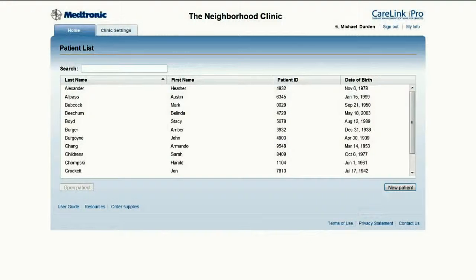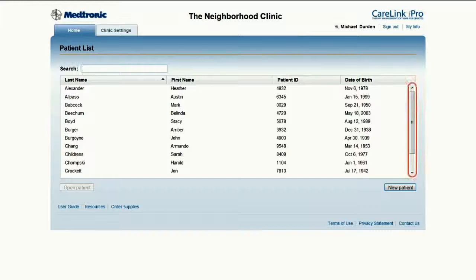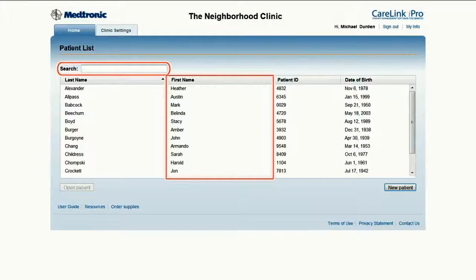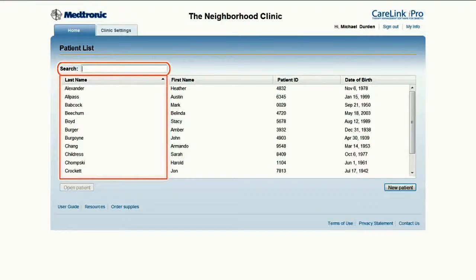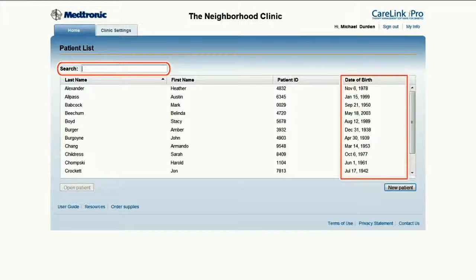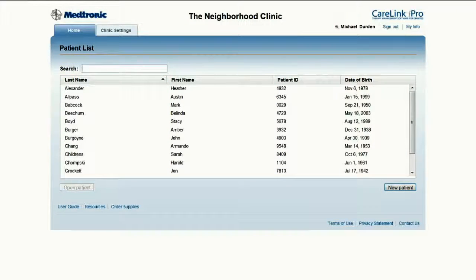Welcome to the main page. Before setting up a new patient, always check that they have not been previously set up. This can be done by either scrolling through the list of patients or searching by first name, last name, patient ID, or date of birth. If an existing record does not exist for a patient, set up a new patient record by clicking on the New Patient button.